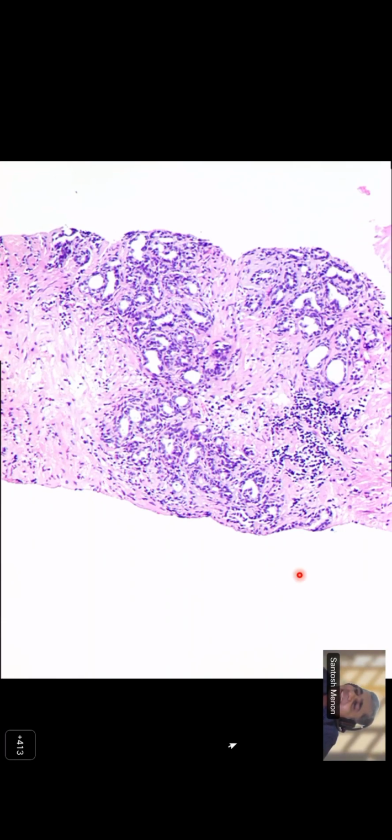Yes, sir. Niharika, we had a class day before yesterday, and I strongly suggested not to try and pick up basal cells and not to comment on basal cells. If you're really thinking that these small glands are malignant, you know that they will lose the basal cells. So you have to be careful. I'm not saying that you should not look for them, but if there is an iota of suspicion in small, rigid looking glands, you should think of doing IHCs. Any difference? You want to add something?